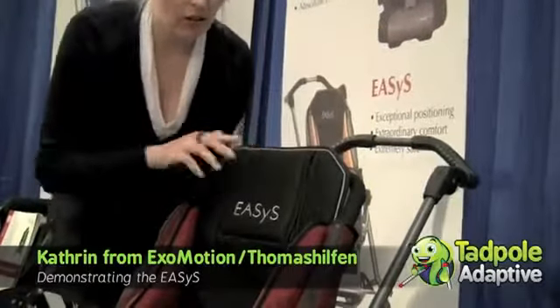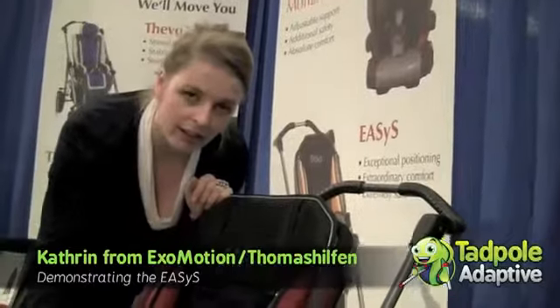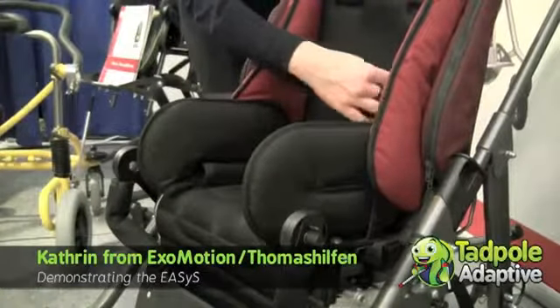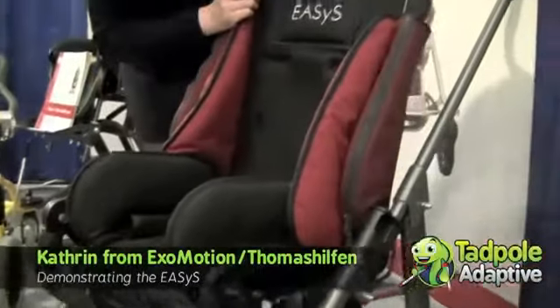You can get all types of different accessories for it. So you can get an abduction block, a two-point pelvis strap, a four-point pelvis strap. We have different kinds of lateral trunk supports and we have a nice shaped headrest.